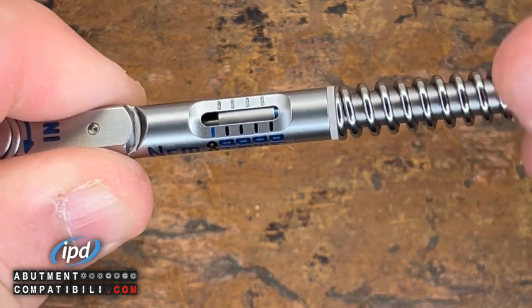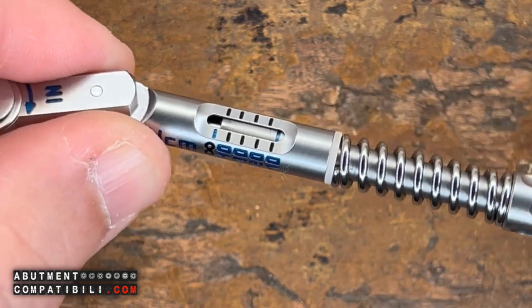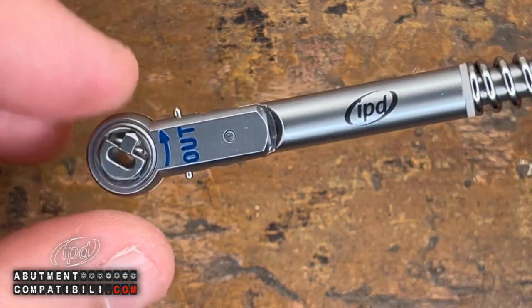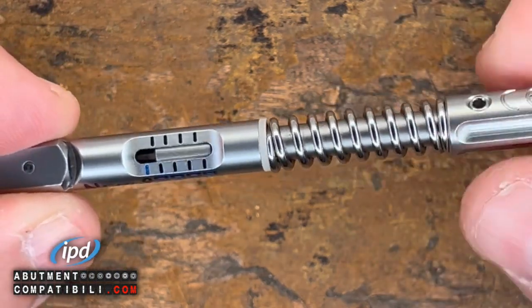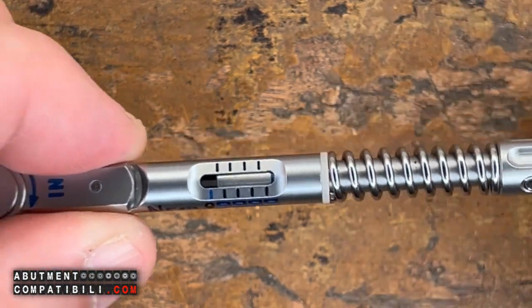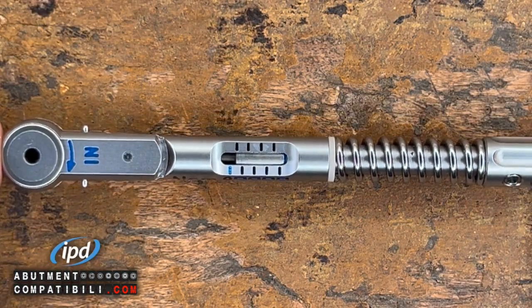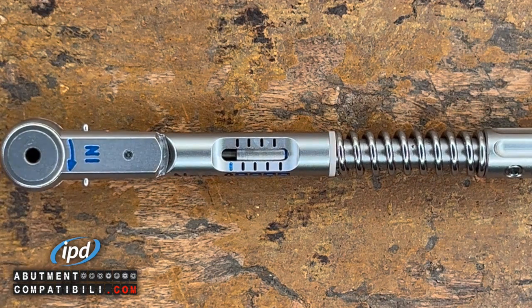So unscrew the spring almost completely and go into decompression. Right now, we are really working under 10 N — we will be at 5, 4, 3 N of torque. In this way, we leave the spring decompressed as soon as it is placed down, to avoid the spring unwinding, and to prevent it from coming apart during sterilization and storage in the warehouse.